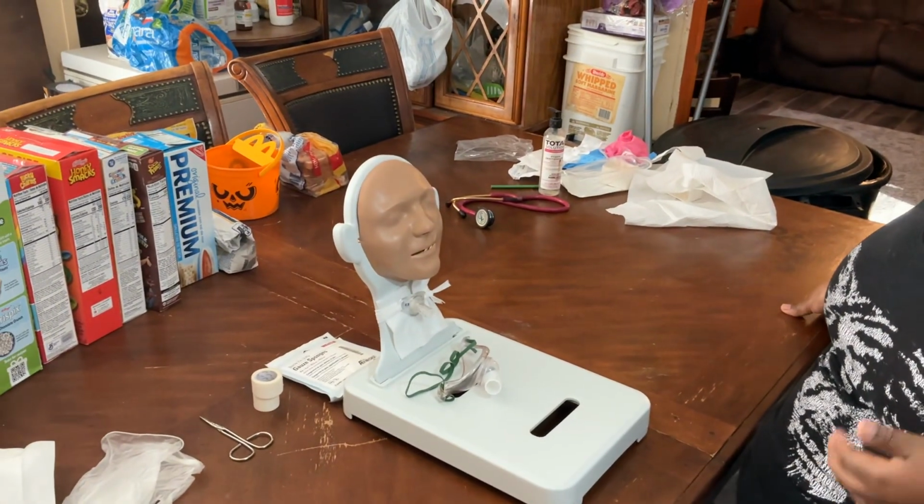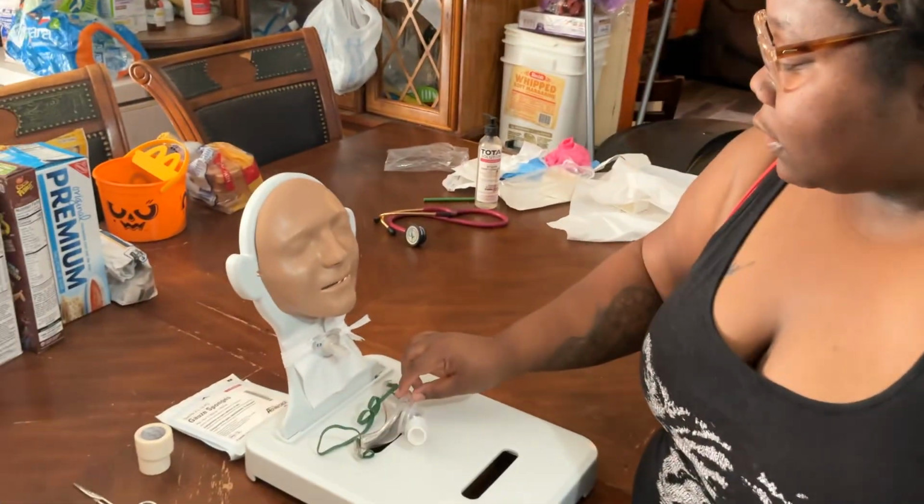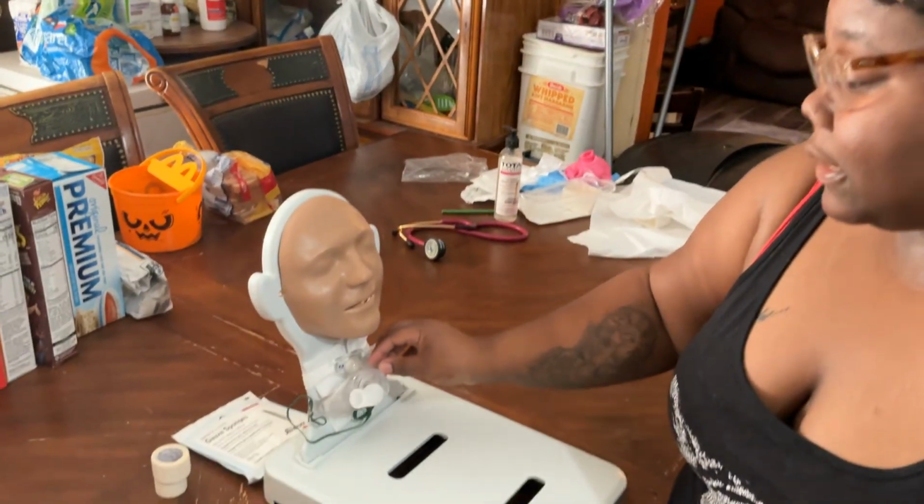Oxygen supply. My bed is in lowest position. My patient is comfortable. No signs of distress. How did you feel about the procedure, Miss John Doe? She said she did well. She didn't have any signs and symptoms of distress. No trouble breathing. Well, that's great. So what we're going to do now, I would have placed that back on my patient. My patient's trach, I will place it back on.